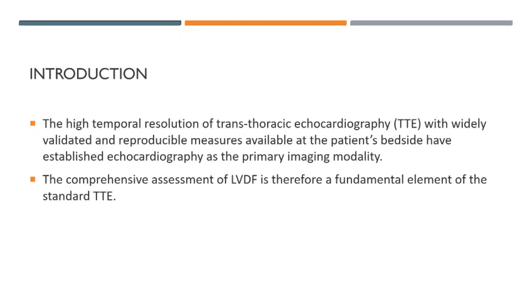The high temporal resolution of transthoracic echocardiography, with widely validated and reproducible measures available at the patient's bedside, have established echocardiography as the primary imaging modality. The comprehensive assessment of left ventricular diastolic function is therefore a fundamental element of the standard TTE.